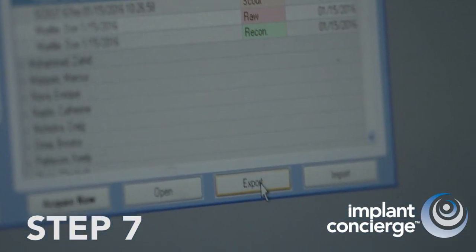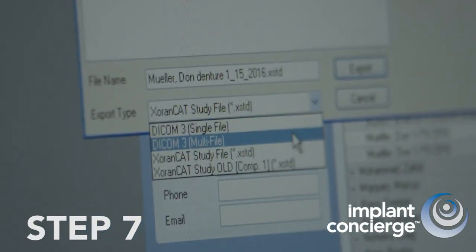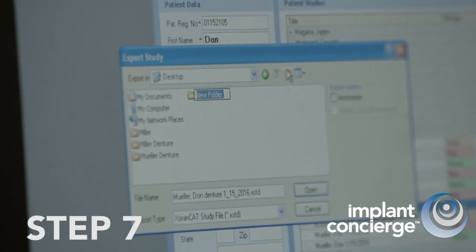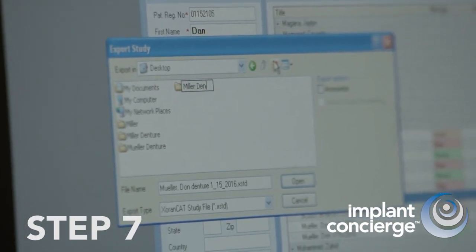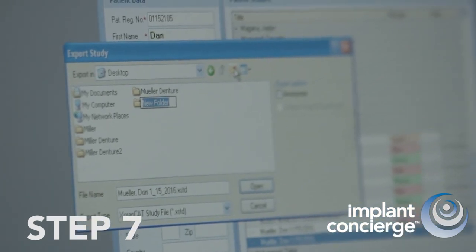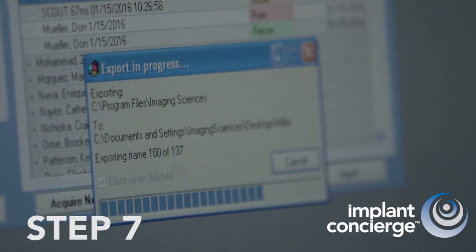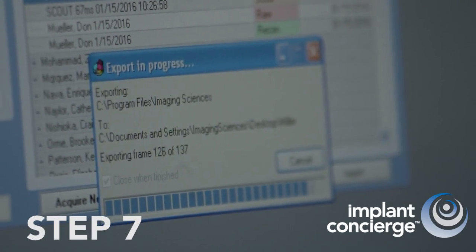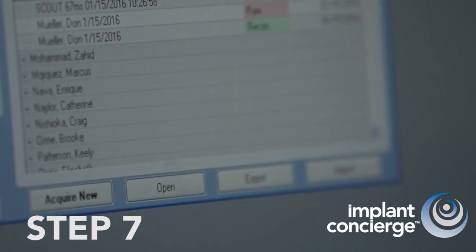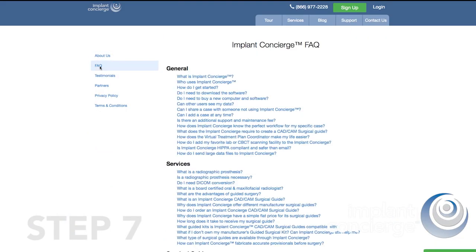Step 7. Export both Cone Beam CT scans to your desktop as a DICOM 3 multi-file. Save the denture-only scan as Last Name Denture. Next, save the Cone Beam CT scan of the patient wearing the denture as Last Name. All Cone Beam CT units are required by law to allow DICOM 3 export. If you do not know how to export the DICOM, reference the Implant Concierge FAQ section or call us for assistance. We can email you your specific manufacturer's DICOM export instructions.